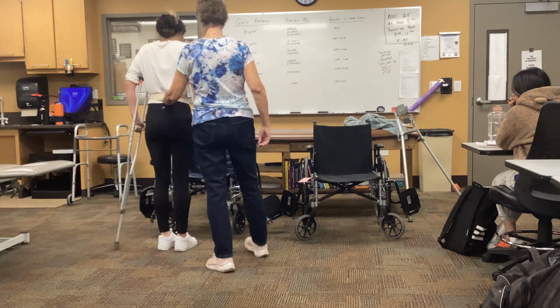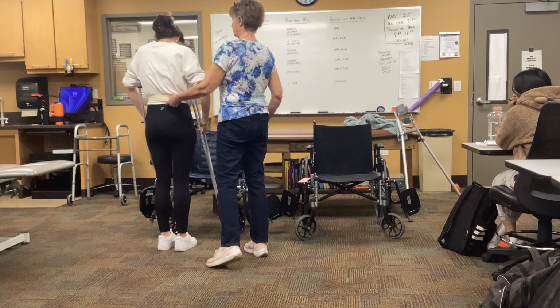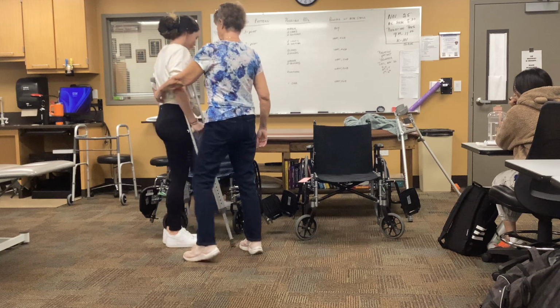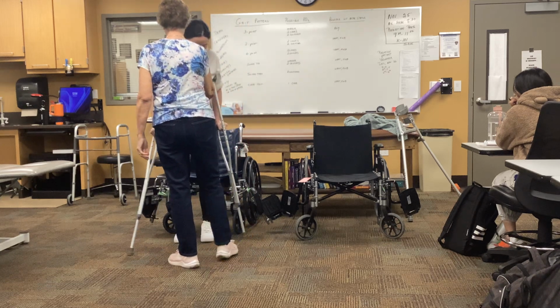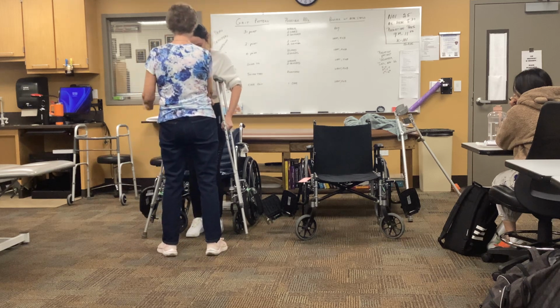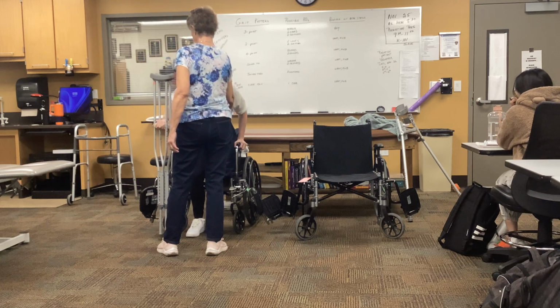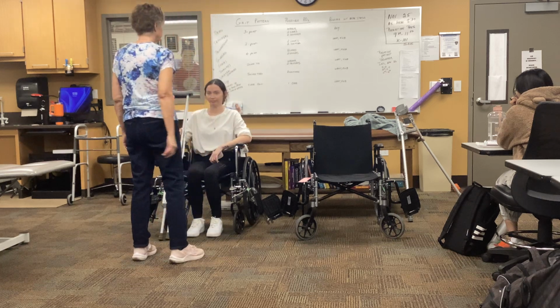Okay, same thing to sit down now. Is that how you sit down with crutches? And now she got stuck. Okay, so probably be a good idea to take that off. Feel back to the chair, and lowers herself down, and then sits in the chair.